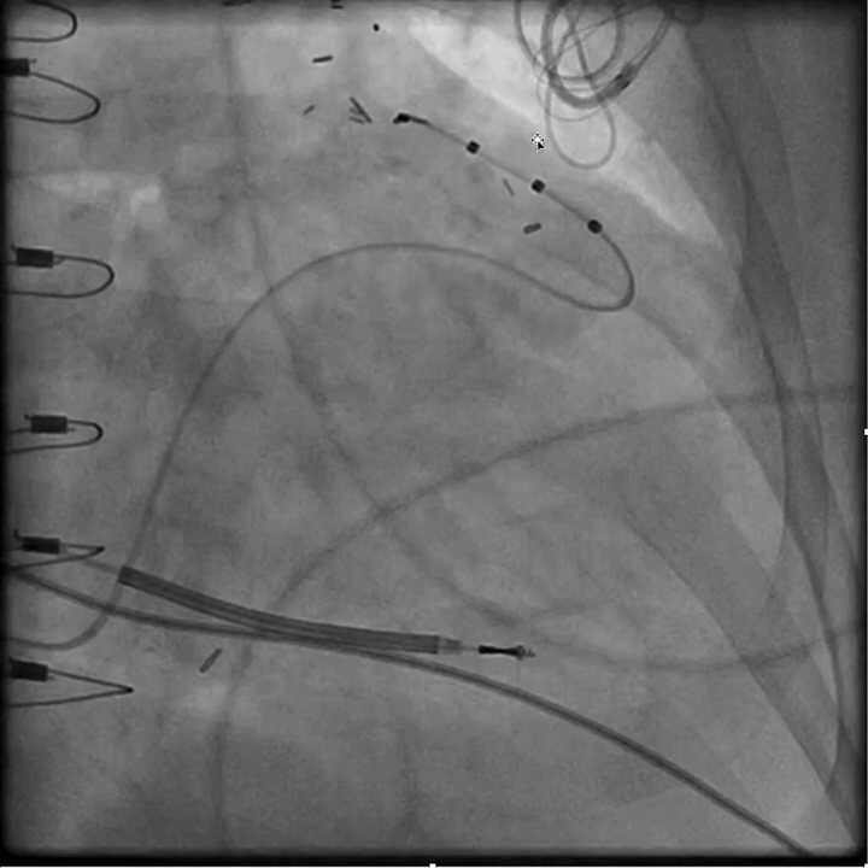So again, this is just adding the microcatheter inside the SureCross catheter to make the snare technique more effective.